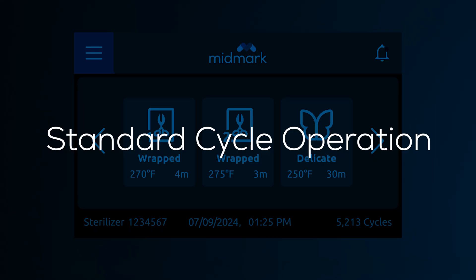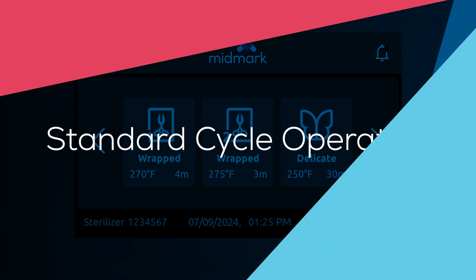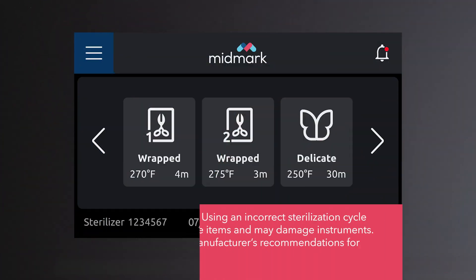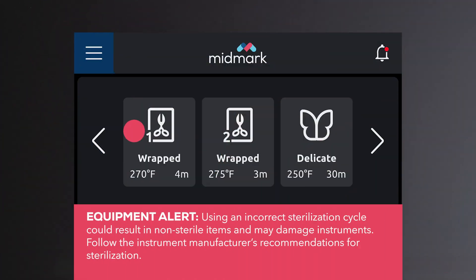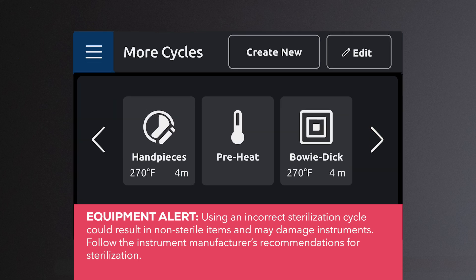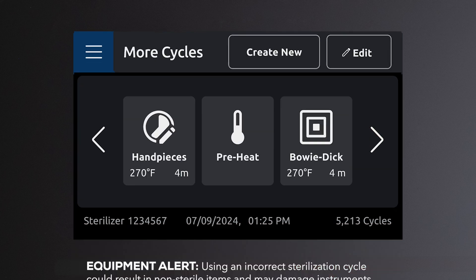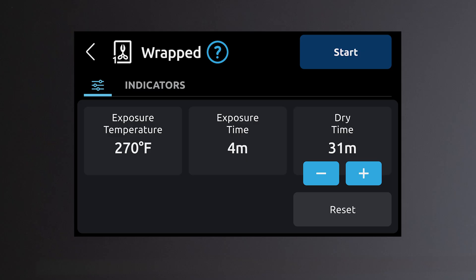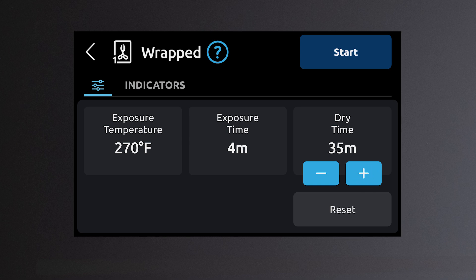Standard cycle operation. To operate a standard cycle, select a cycle or use the right arrow on the main screen to locate the additional cycles. Refer to the standard cycle parameters chart for sterilization time and temperature specifications to match with instrument instructions for use. Dry time can be adjusted from 5 to 60 minutes in 1-minute increments. Once you have the cycle parameters set, press start.